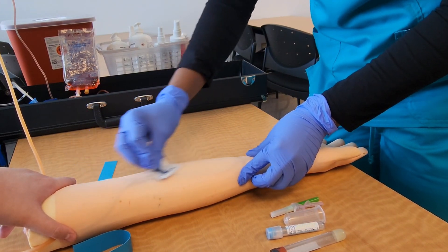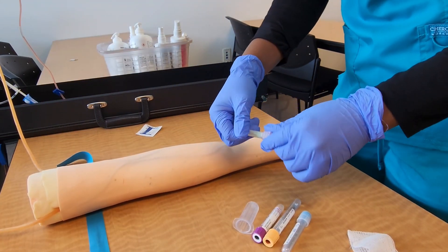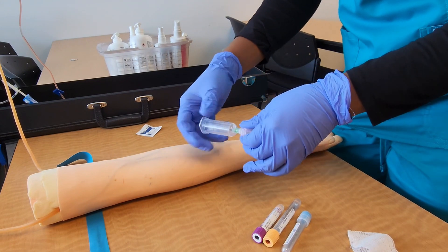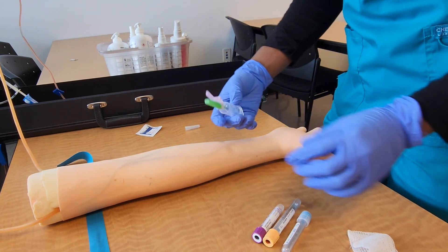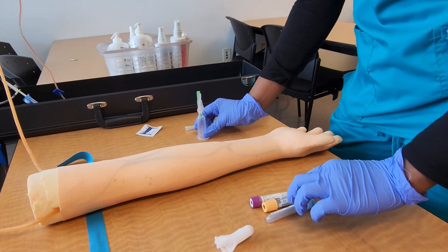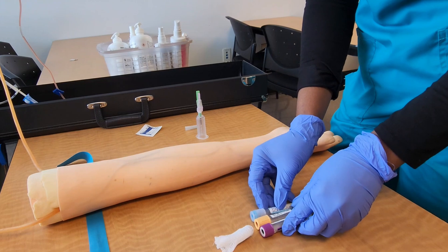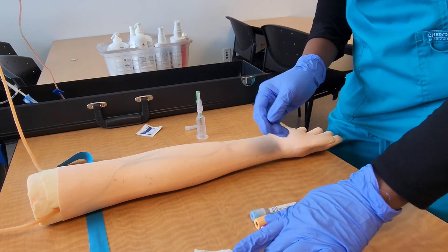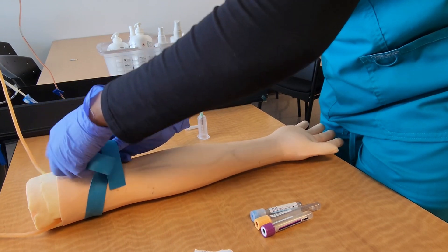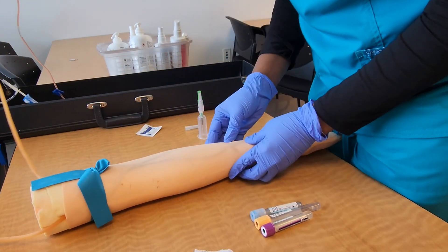You can see me going back and forth with the alcohol pad while the site is drying. I'll go ahead and assemble all my equipment. Here I'm attaching my multi-sample needle into the hub — I'm using the BD Eclipse needle. The safety device is attached to the needle. I'm arranging my tubes in the correct order of draw, then I'll re-tie my tourniquet. Make sure not to re-palpate the site you cleansed earlier.